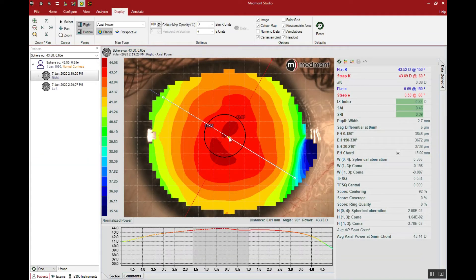Next, let's look at the candidacy of this eye for orthokeratology. When you evaluate your pre-fitting topography, what indicates whether a patient is a good, poor, or slightly challenging candidate? The first thing we observe is the presentation of the astigmatism or the power of the central cornea. Let's go to display and select the axial map. Axial allows us to assess visual indicators — does the anterior surface present itself in a way that will bend light optimally to the retina? Here we see a cornea that's relatively spherical, and because of such low central corneal astigmatism, we'd presume this would be a fairly straightforward ortho-K case.